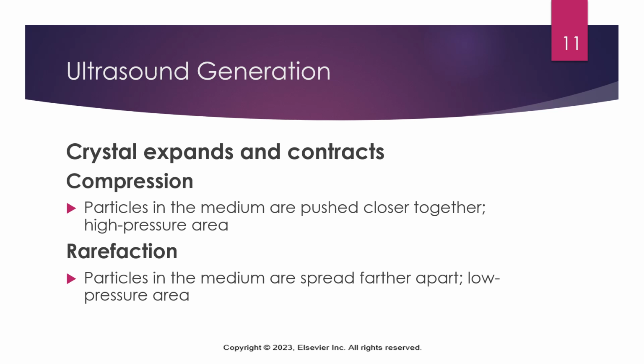So let's talk about now compression and rarefaction. With compression, the particles in the medium are pushed close together, and this creates a high pressure area. With rarefaction, the particles in that medium are spread further apart, which creates a low pressure area. So the compression and the rarefaction create those sound waves that travel through the body to deliver those therapeutic effects.